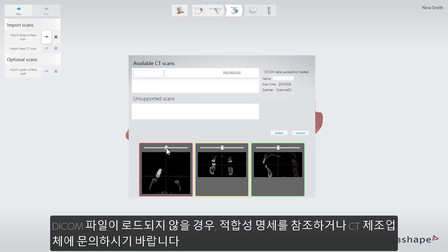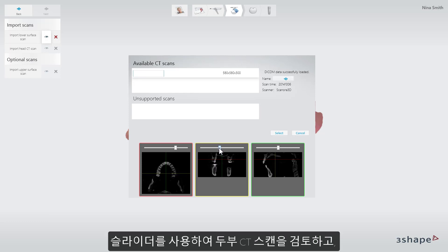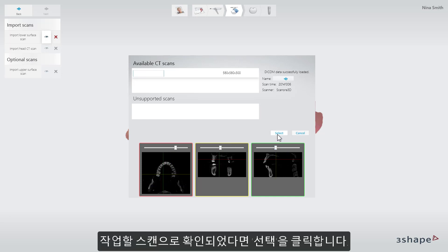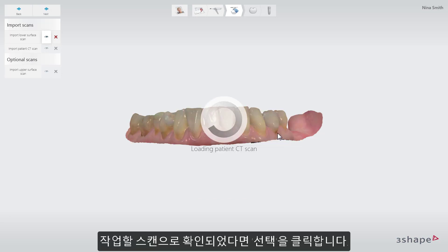If a DICOM file fails to load, please refer to the Conformance Statement or alternatively contact your CT manufacturer for clarification. Review the Head CT Scan by using the sliders, and click Select to confirm that this is the scan you want to work with.